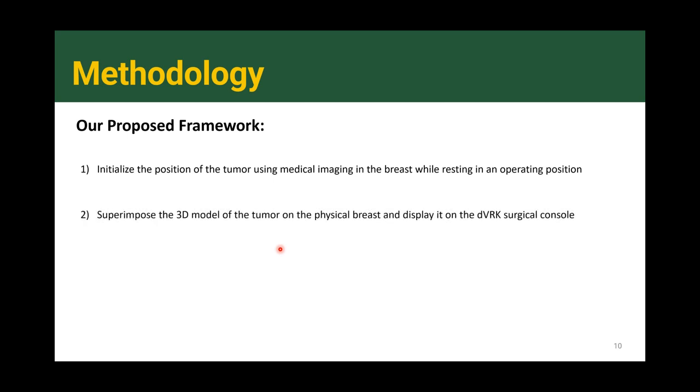So to address the initial question that I proposed in the motivation, and now using the fundamentals that we have seen, in our framework, we want to initialize the position of the tumor using medical imaging in the breast, while the breast is in a resting position in the operating room, just as the patient is laying down for the operation.